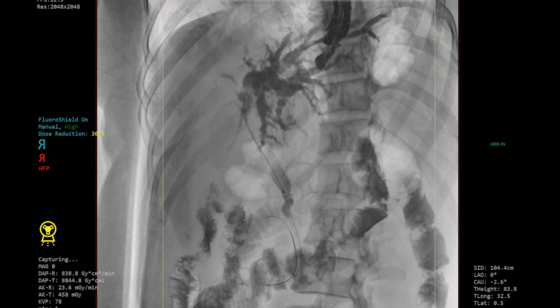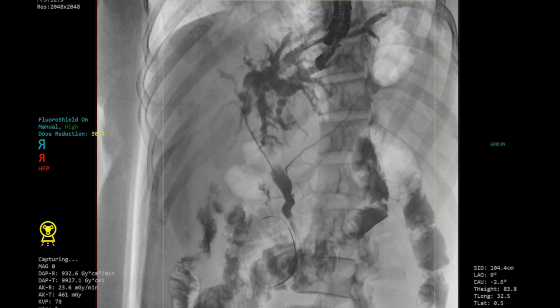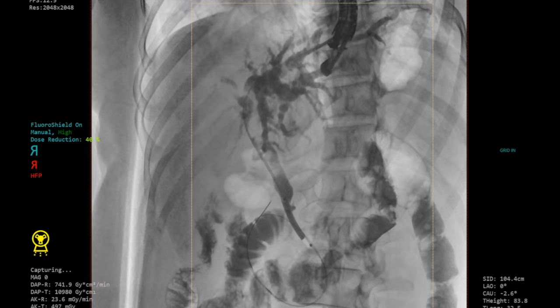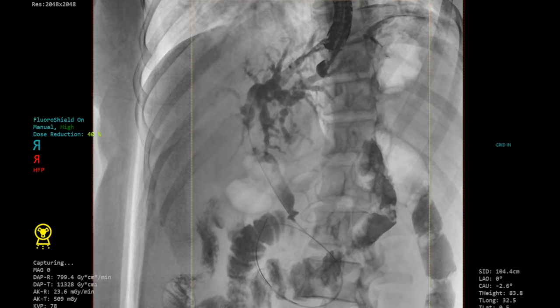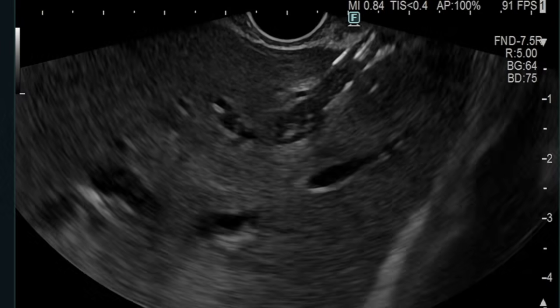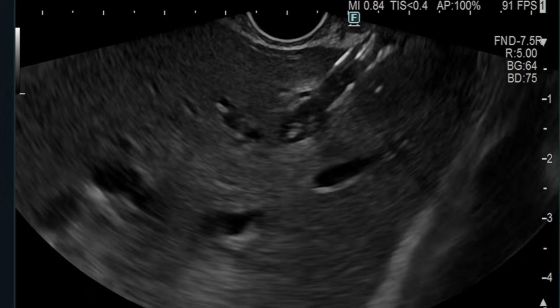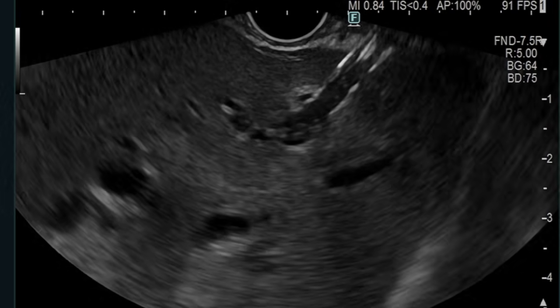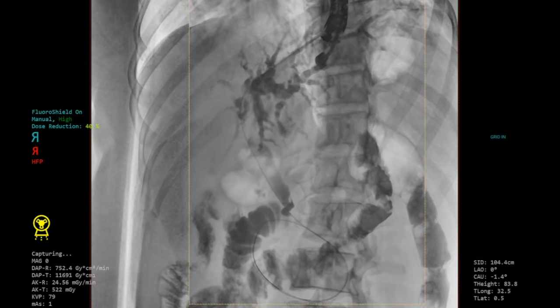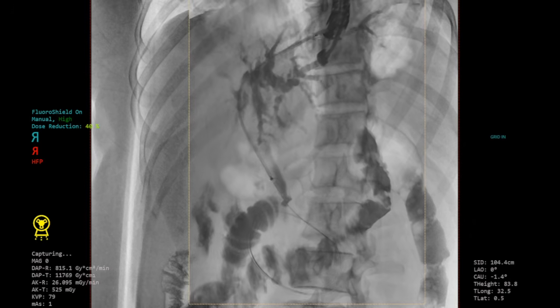After coiling a generous amount of guide wire into the duodenum, the cystotome is exchanged for a 4 by 4 mm Hurricane balloon. The balloon should be first advanced to the ampulla for dilation. It is then retracted so that the transgastric tract is dilated to 4 mm or less, again on sonographic view in plane of access. It is important to dilate the ampulla first and not the other way around, as a partially inflated balloon will not traverse the papilla. Once the transgastric tract is dilated, it is important to proceed efficiently and in a timely manner to minimize bile leak.